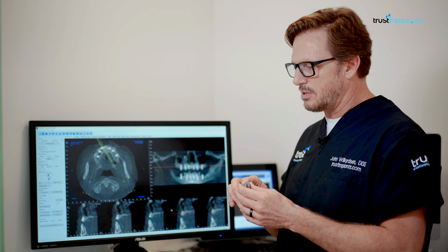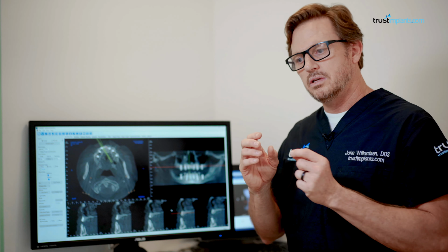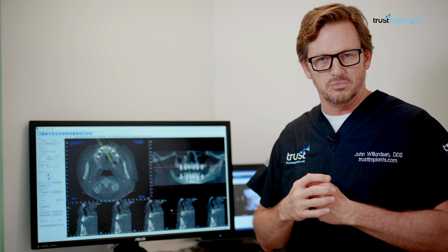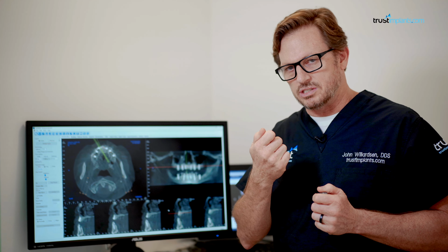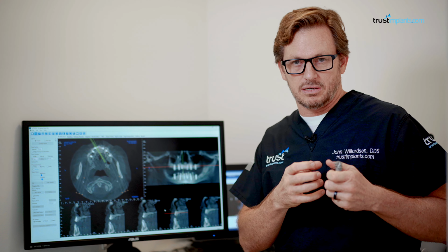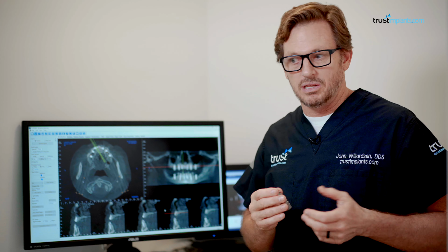And again, we talked about the Straumann BLX implant, which is what I used in his case. In the preparation of the hole, when we're putting these implants in place, I can remove less bone. I can compress the bone rather than remove it. And that's really all the difference is. But I get a good purchase of the screw, or the implant, as it drives into that bone. I can feel that resistance on the implant as I'm placing it. And so I get really high torque values when I'm placing the Straumann BLX implant.